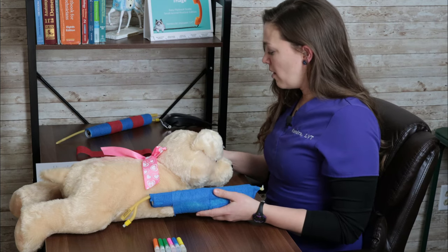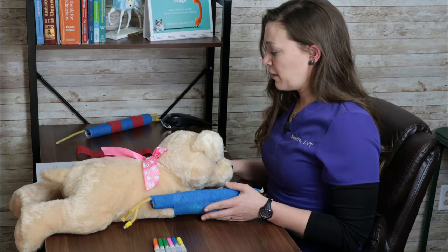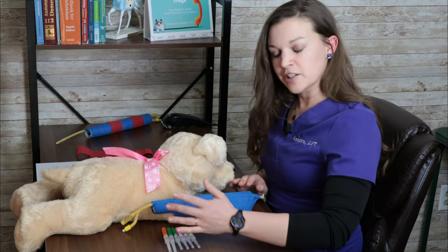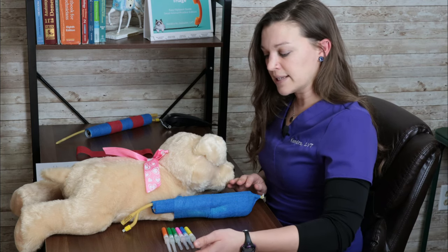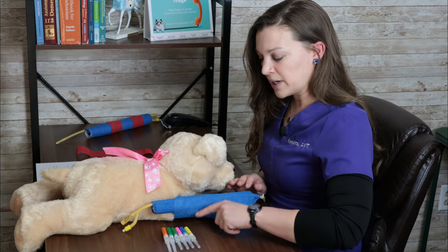All right, now that we're all clean, let's be sure that we've selected the appropriate size catheter for our patient. So I have several displayed out here. We use 14 gauge. Sometimes you'll see those around small animal clinics. We use them a lot in large animal. I have 2 18 gauge, 1 nice long 2-inch one, and 1.25 inch, a 20 gauge, a 22, and a 24.